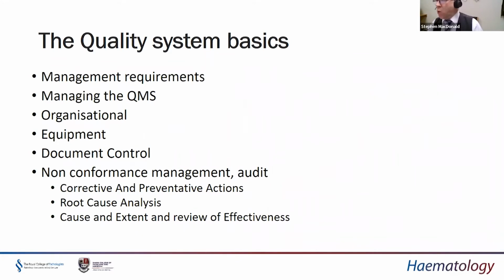So if we think about a quality system, there are two separate aspects to look at: managerial requirements and technical requirements, and we take them as separate entities. We can think about managerial requirements. That's really the framework that's held within the laboratory that enables the laboratory to provide a quality analytical service.